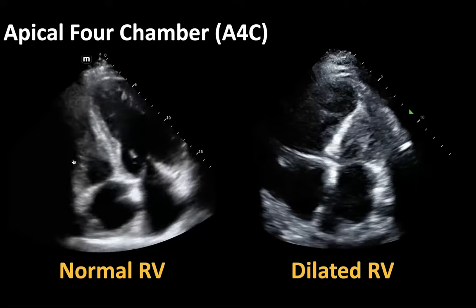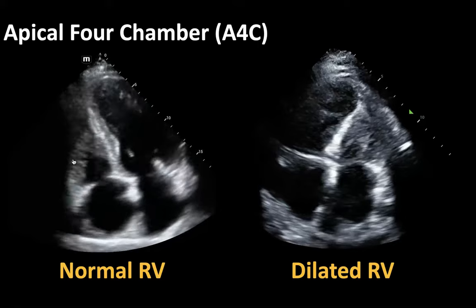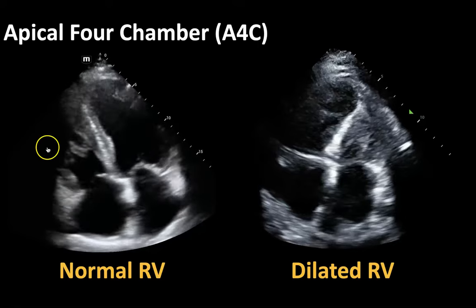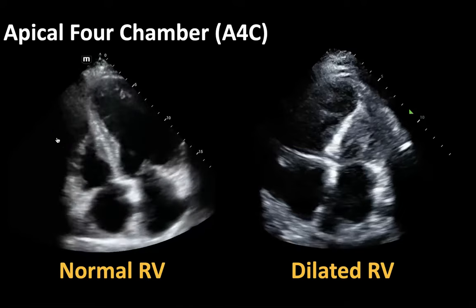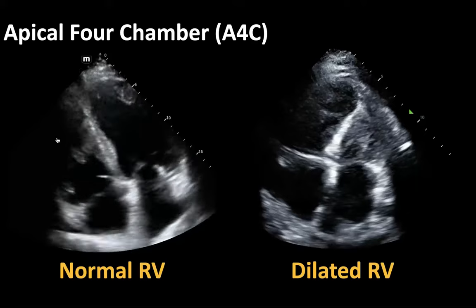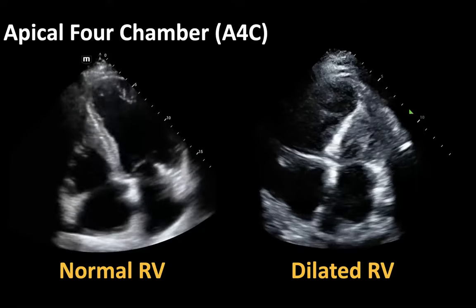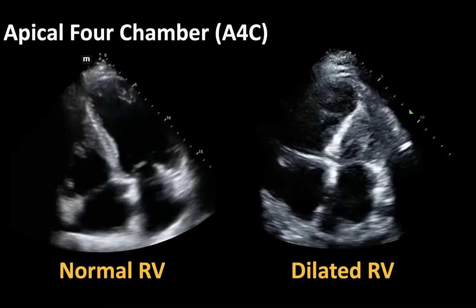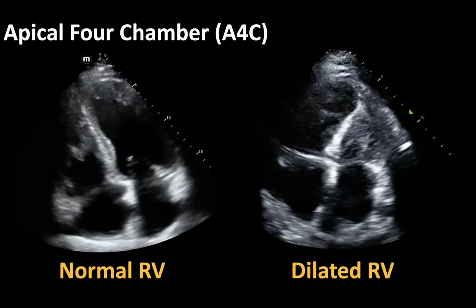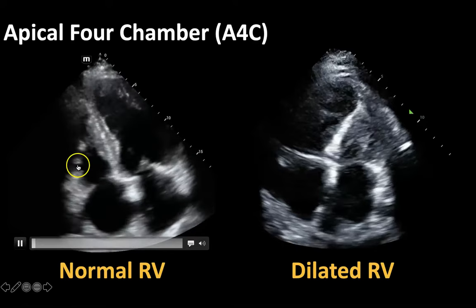In an acute setting we always worry about pulmonary emboli causing a large increase in pressure in the pulmonary circulation that's backing up and causing dilation of your right ventricle. This can also happen chronically in people with severe long-standing lung disease like COPD, which over time can cause dilation of the right ventricle. The acute or chronic distinction is not important to us right now — what I really want you to appreciate is just the difference between the left and right ventricles.